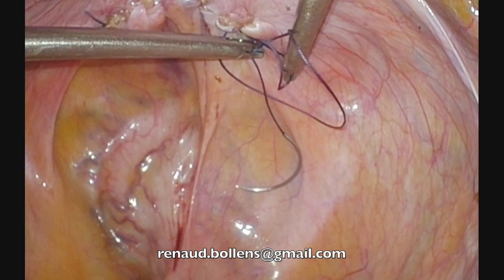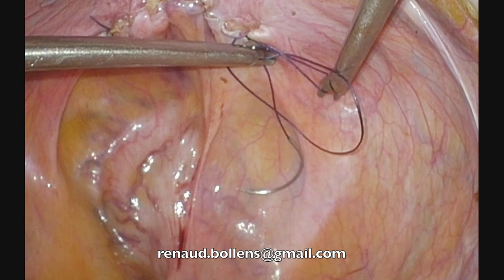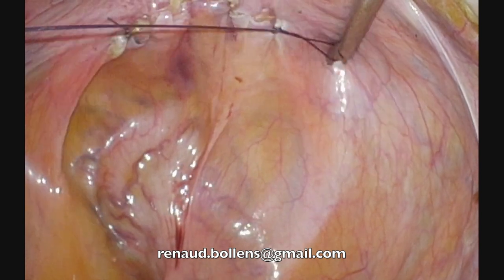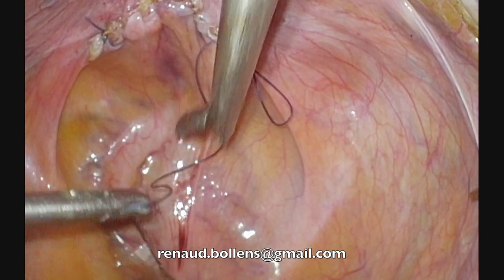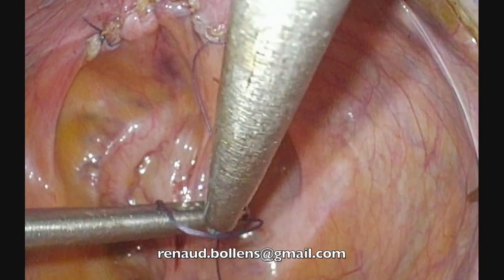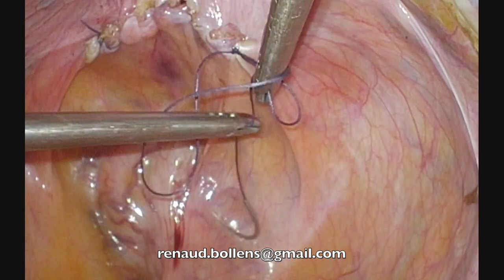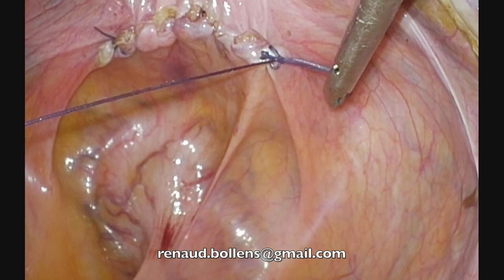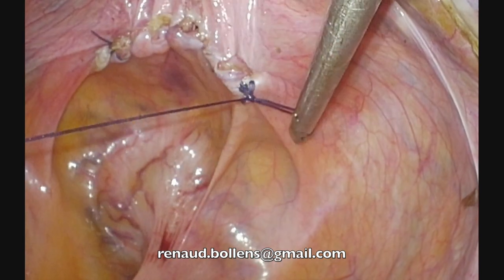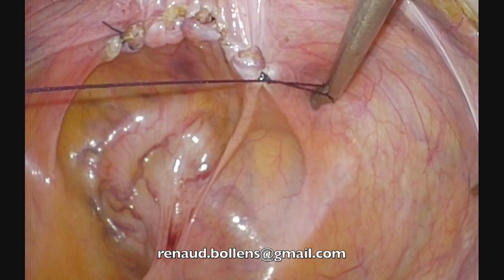I jump over, as usual, but here before I tighten, I open the needle driver to apply the same tension on both sides. And now I have a good knot. If you don't do that, what can happen? You take a little bit asymmetrically, or here I do that a little bit too much. And when you tighten, you see what happened? You have an additional loop on the knot, and the knot is not completely down. And you have to release, to retighten, and then you waste time.